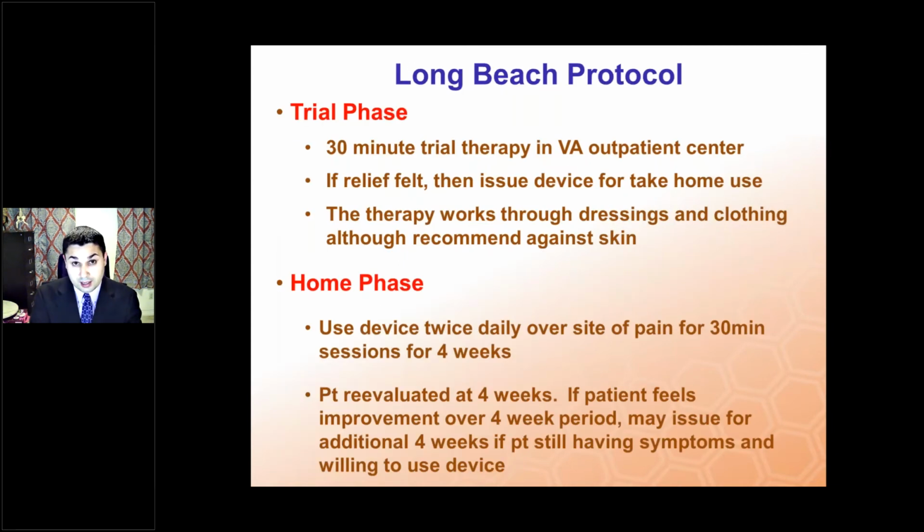At the Long Beach VA, it became known as the Long Beach protocol on how we would do these trial phases and issue the device to the patients. Basically, it's similar to what I told you. Before you issue the device to the patient to take home, they would come in and use the device for 30 minutes, and if they're reporting pain relief, then we would issue it to them to take for 30 days, and we'd extend it up to 60 days. Nowadays, it can be extended even further, up to potentially 120 days, but at the time of this design, most of them would get 30 days, and if they asked to extend it to 60 days, we would do that for them as well, up to their preference. So that's how we did our protocol.